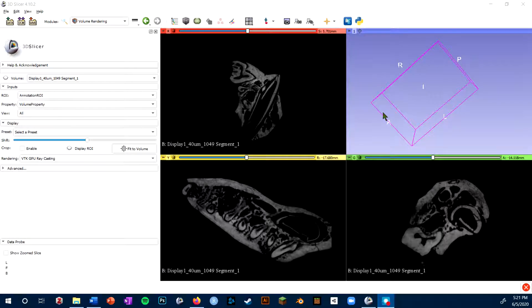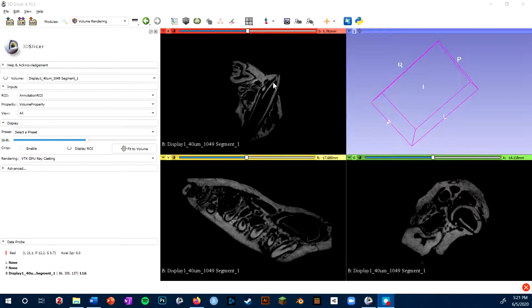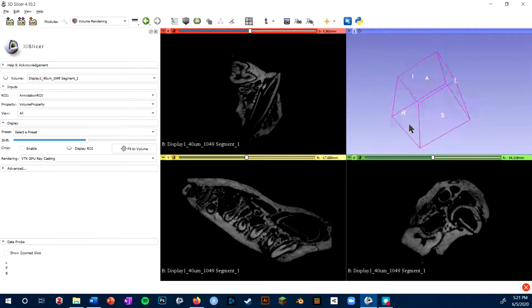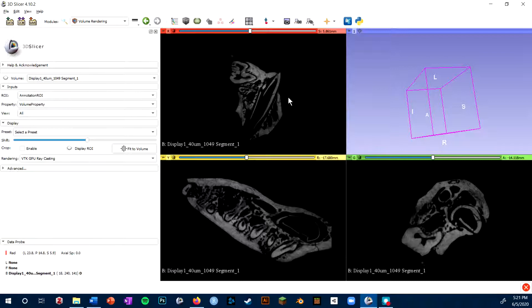You can render volumes in Slicer using the volume rendering module. I currently have a volume loaded that's visible in the slice views, however it's not showing up in 3D. That's because I haven't rendered it yet.